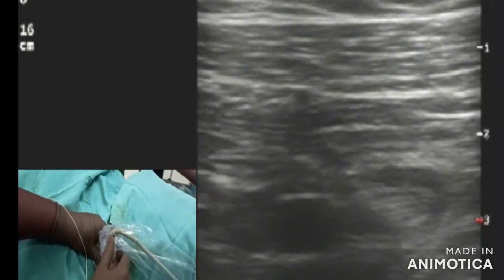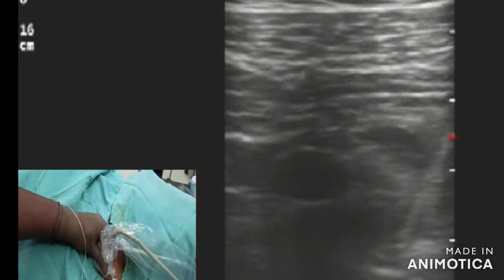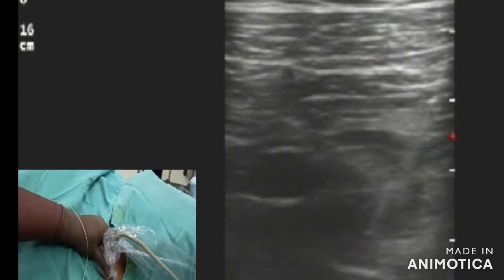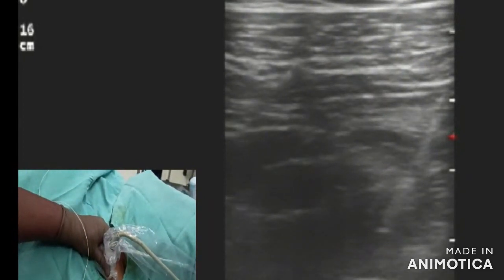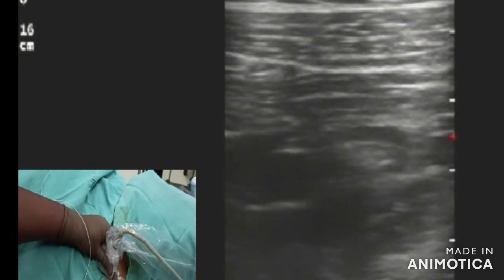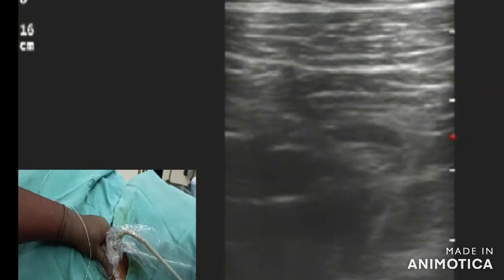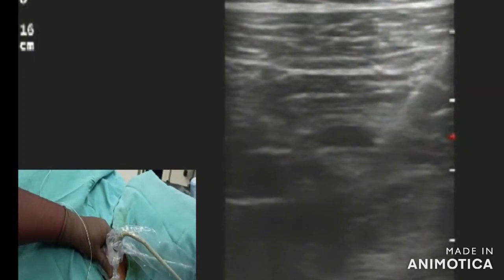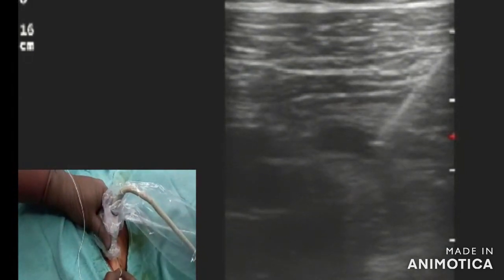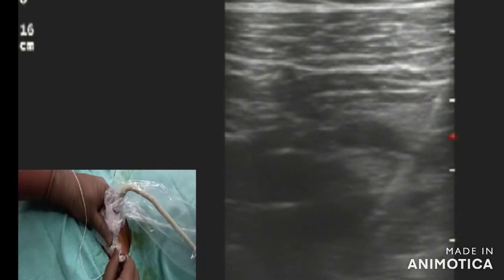Here you can see local anesthetic being injected. You can see the lateral cord being nicely separated. Now the needle is between the posterior cord and the medial cord as the drugs are being deposited. You can see the axillary vein and the axillary artery pulsating. You can clearly see the connective tissue separating the lateral cord and the medial cord, with the posterior cord and medial cord nicely placed within that connective tissue.